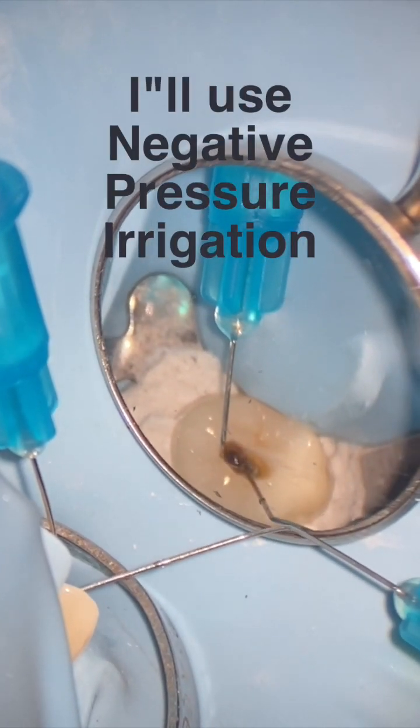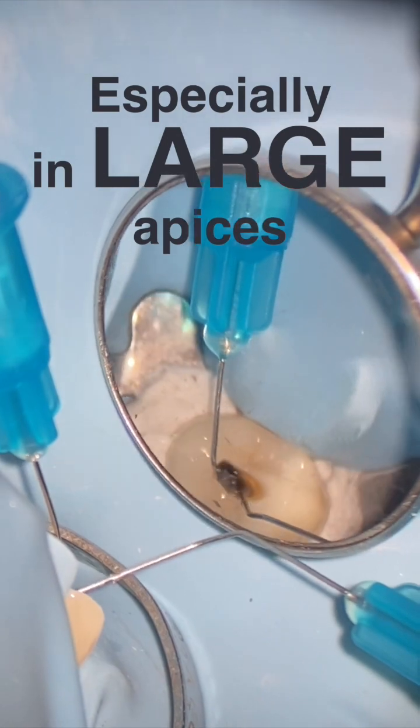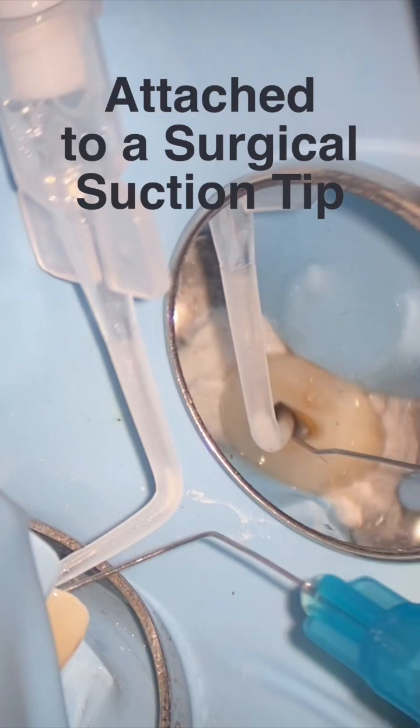So I'll use negative pressure technique to circumvent that issue, and it's pretty simple. I'm just going to use a BC sealer tip or an irrigating tip attached to my dental system suction.